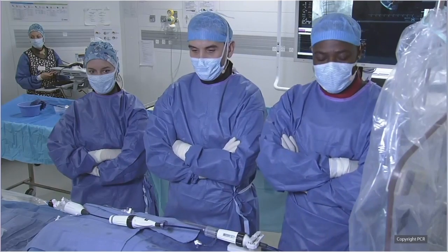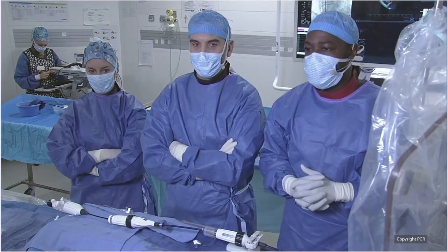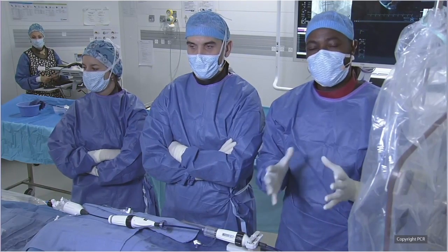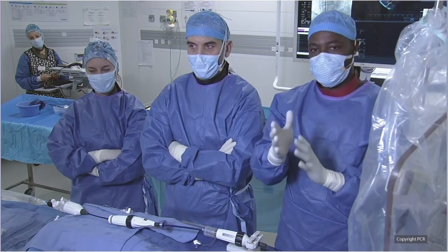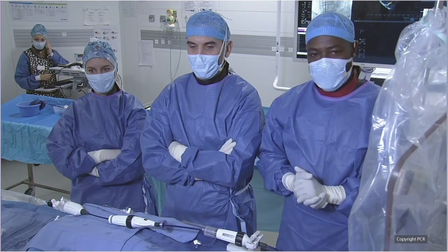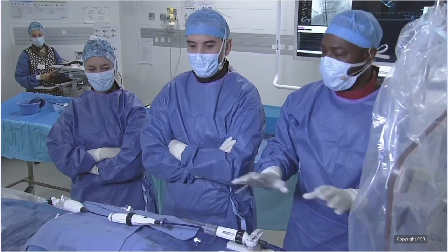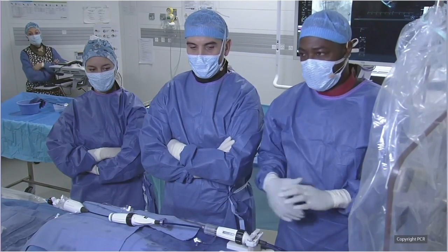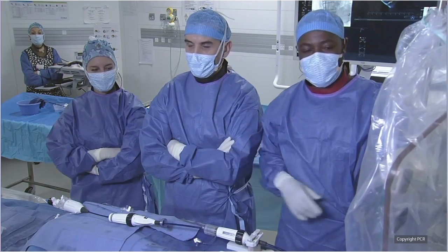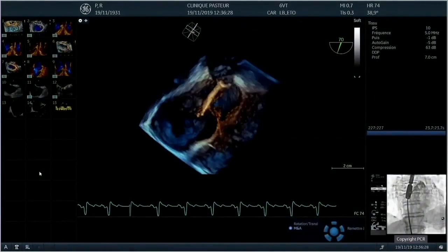Thank you very much, Nico. So, you've discussed the case, so you know the patient. It's not an extremely challenging DMR patient. So, we aim at placing one PASCAL in the A2P2 region. It's going to be a little bit lateral, as Becky, you just nicely demonstrated. So, we will try to help you understand what the features are. You've described that before. So maybe we can review together what we've done. Nicolas, that's something that I've learned from you. Can you put the fluoro, please?